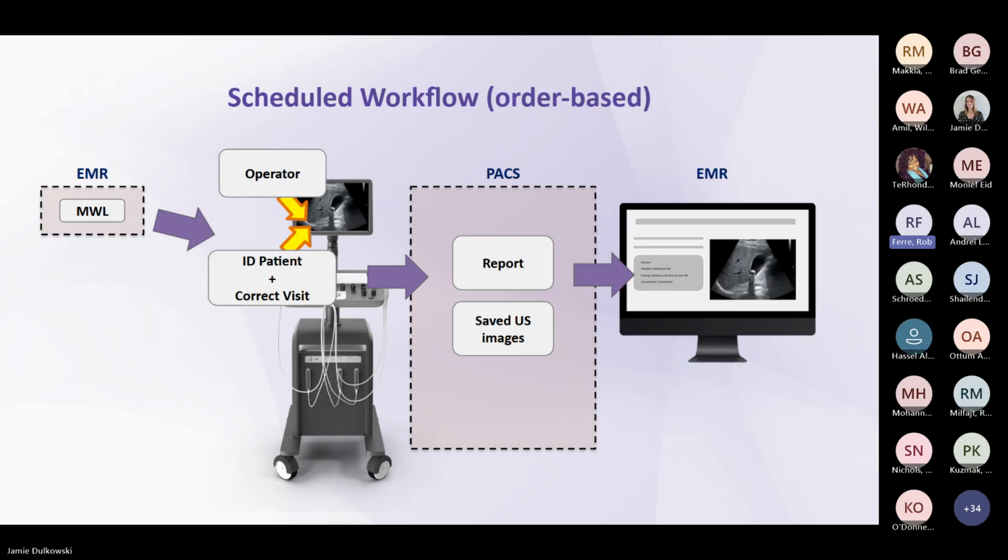Work had been done previously by early founders using a scheduled workflow where, using a traditional radiology-based imaging workflow, an order would be placed by the clinician. The operator would be identified, the correct patient was identified using this modality work list, and it went through PACS and eventually into the EMR. But the problem is clinicians that are seeing patients don't order themselves to do anything. I don't order myself to auscultate someone. I don't order myself to palpate someone's abdomen. So it's very disruptive to the workflow, and it's not how we do work.